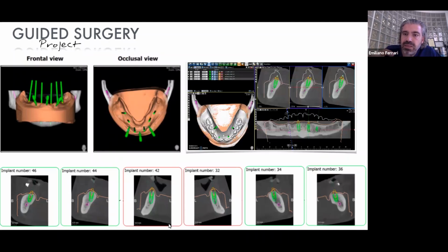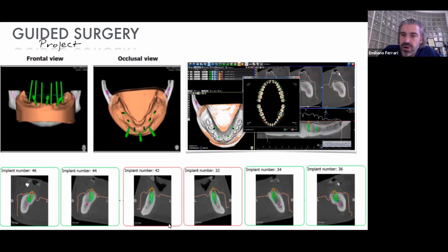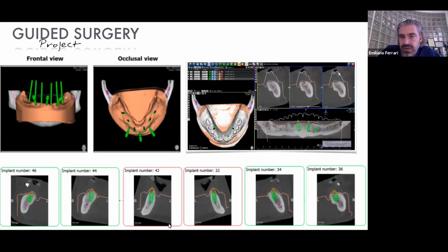The same abutment used in removable and fixed rehabilitation needs a different height. So in the removable rehabilitation, we have to stay outside of the gum, so we need a height that is at least 1 millimeter over the depth of the gum. But when we go for the fixed rehabilitation, I prefer to stay inside the gum to avoid aesthetic mistakes, specifically in the upper jaw.